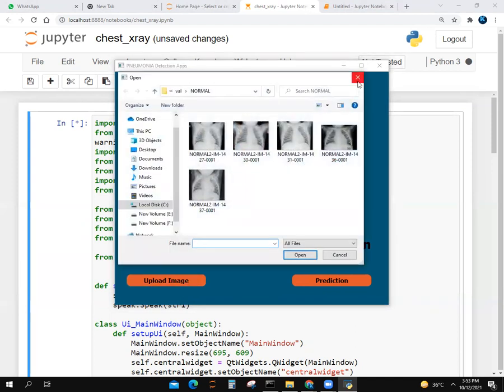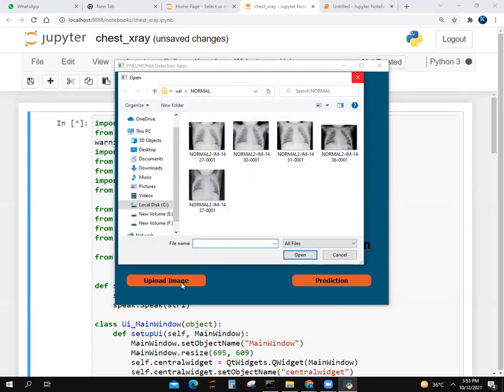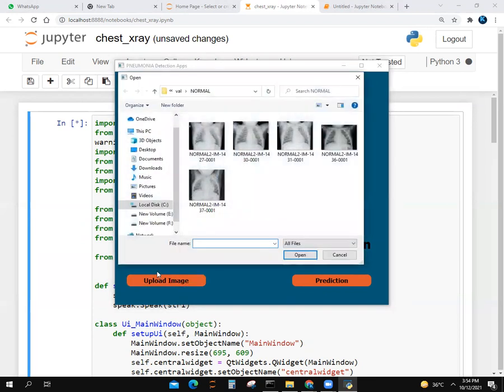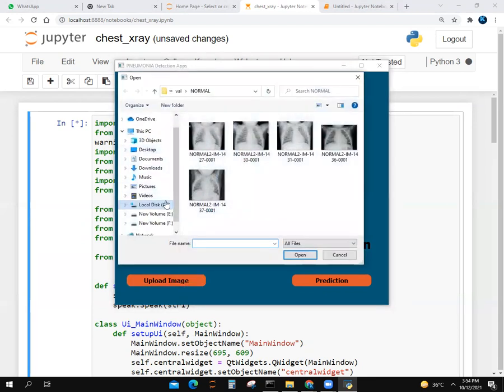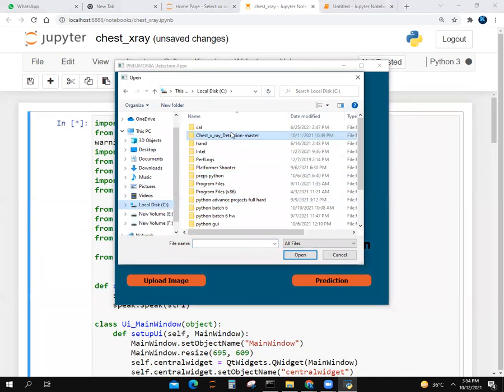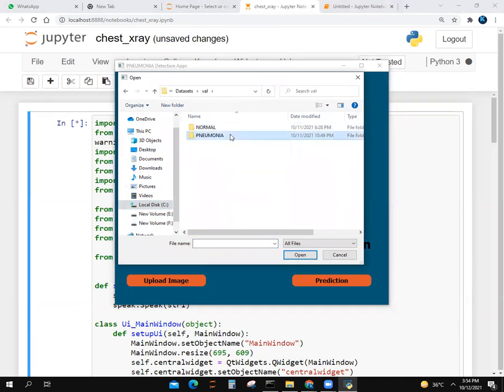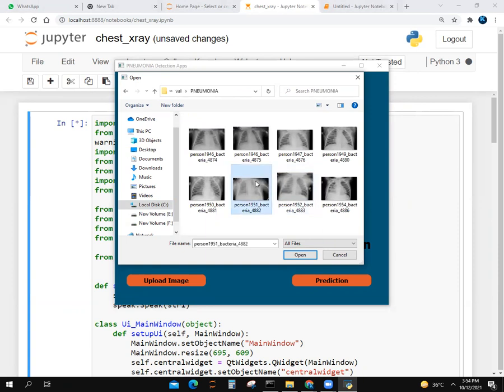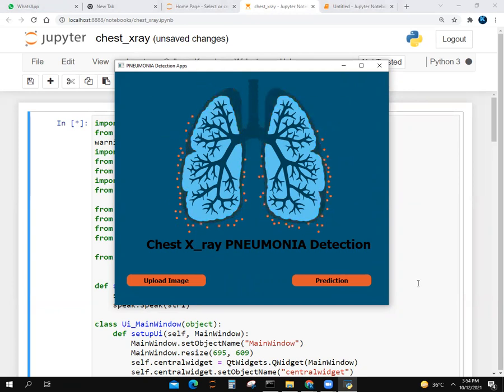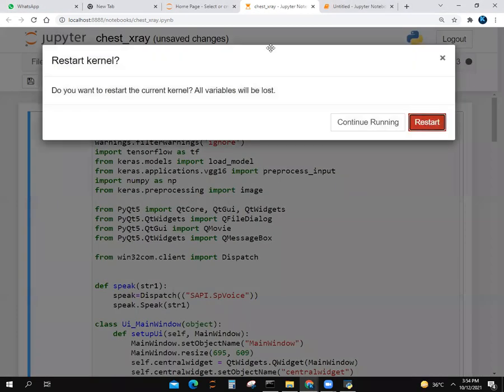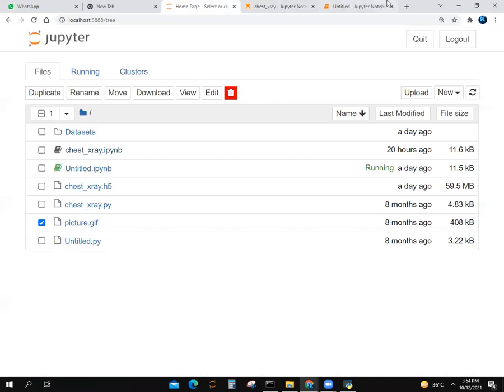I think you can't hear the voice of Jarvis. If you run this code, you will hear it. Let's go to chest x-ray dataset, validation, pneumonia. Let's take this picture. Prediction. It says affected by pneumonia. And here's the image. Let's stop the code.